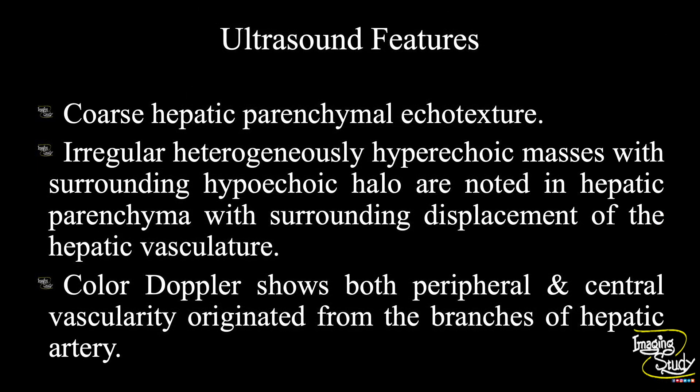In summary, hepatic parenchyma echo texture is coarse. Irregular heterogeneously hyperechoic masses with central necrosis and surrounding hypoechoic halo are noted in the hepatic parenchyma, with surrounding displacement of the normal hepatic vasculature. Color Doppler shows both peripheral and central vascularity originated from branches of the hepatic artery. These features suggest a case of hepatocellular carcinoma on the background of chronic liver disease.